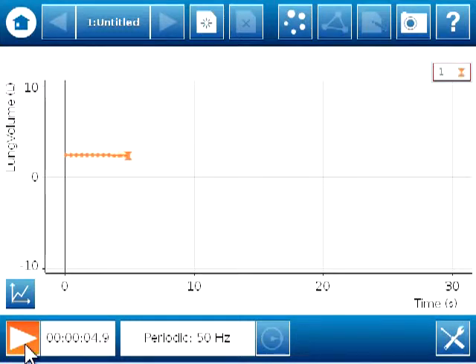And there are two lights on the spirometer sensor. Initially, the red light will blink and it says wait. And then shortly after that, the green light will blink and it says ready. So when it says ready, I can pick up the spirometer and I can hold the tapered end of the mouthpiece in my mouth, kind of holding it between my teeth and letting my lips form a seal around the spirometer. And I'm going to just take normal breaths, making sure I breathe only through my mouth and not through my nose.